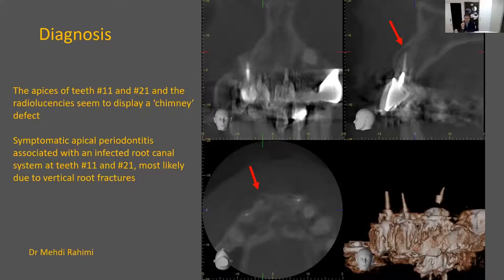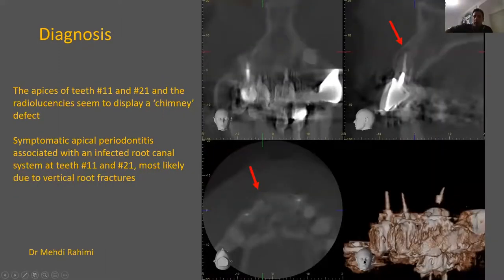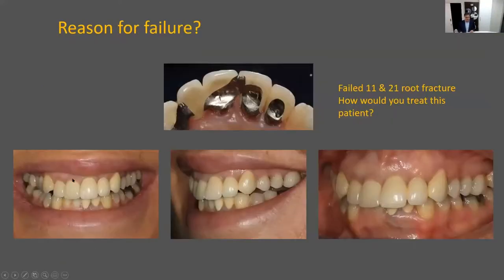Interesting what you say. Another colleague, a periodontist, wanted to explore surgically to see if it's a root fracture or not. And I said, nonsense. With a high smile line, I can't afford exploratory surgery to ascertain a root fracture. It was another endodontist prior to me, and I said, look, the cone beam is so clear cut. There's no point in cutting and ending up with a scar, especially as I didn't want to damage your smile line and what you're about to do next. I need this bone to maintain your gum integrity and symmetry, although it's asymmetric here, I still have a safety zone to play with the gums. That's later on in the reconstructive work.